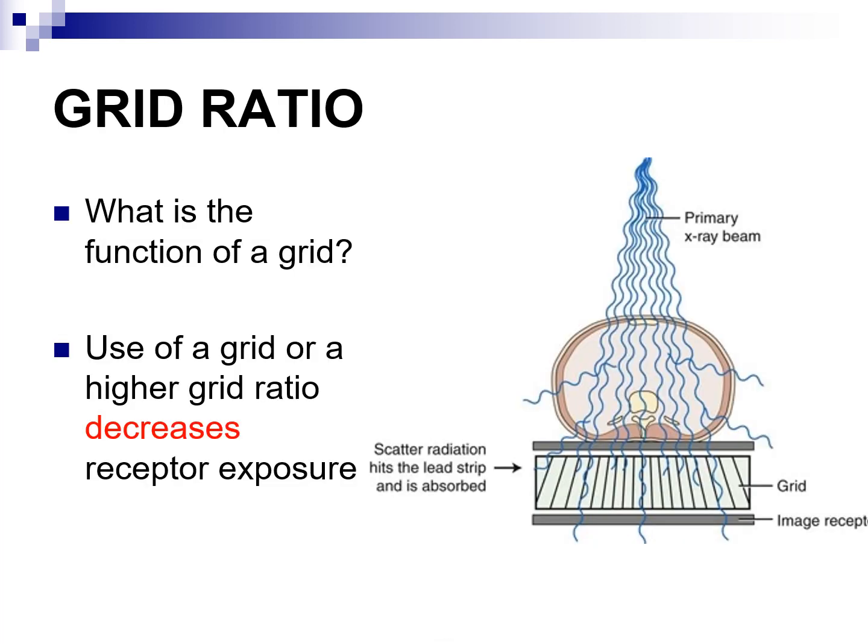Grid ratio. What's the function of a grid? Well, it's going to increase contrast. The use of a grid or a higher ratio grid is going to decrease receptor exposure.